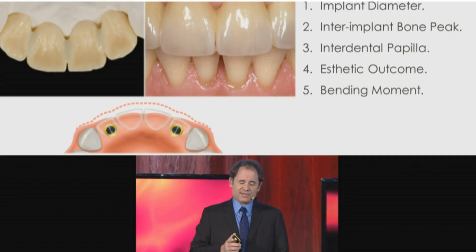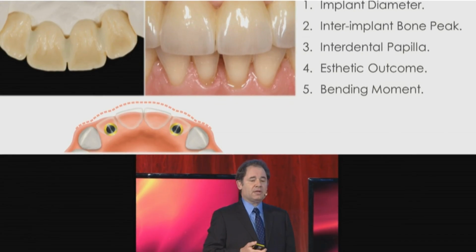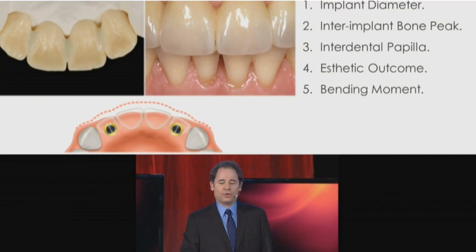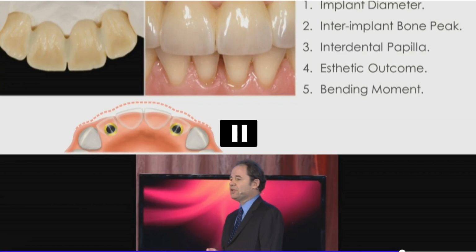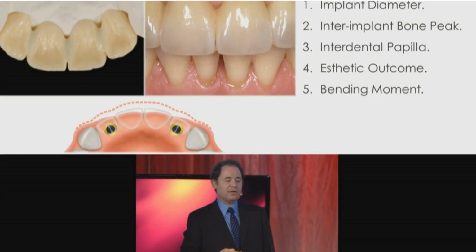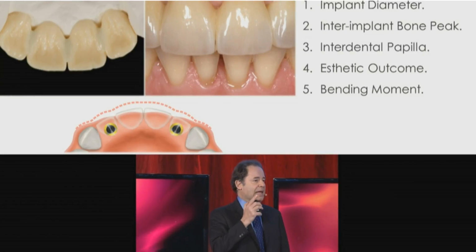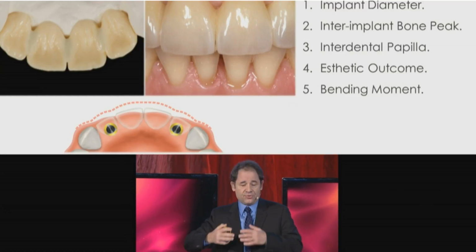So let me digress for a second, because I want to show you this case here done by a very good technician, a friend of mine. You are looking at a 2 lateral incisor implant situation, and you're looking at a 4-unit. You're looking at the wax-up on the left, and the restoration was an Emax lithium disilicate 4-unit fixed partial denture. Look what's happening. It fractured very quickly in function between the central incisors. Why? Emax, of course, is an excellent material, but the problem with any ceramic material is when you take it to the limit. And from there, anything can happen.